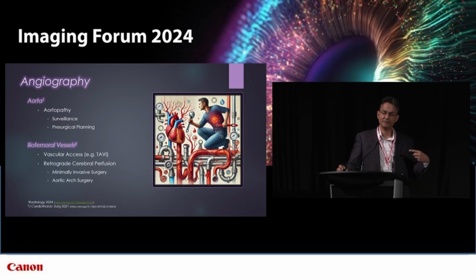For those unfamiliar, this is an alternative to cardiopulmonary perfusion. So instead of putting cannulation sites in the ascending aorta and in the systemic venous side, the atrium or the SVC or IVC, they can actually use either axillary cannulation or femoral cannulation. If they're using femoral cannulation, they need to drive up the systemic perfusion from the groin up to the brain. So if there's plaque there, it's critical for them to know about that.